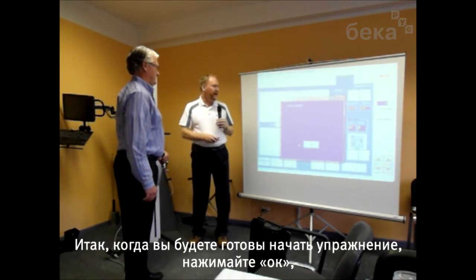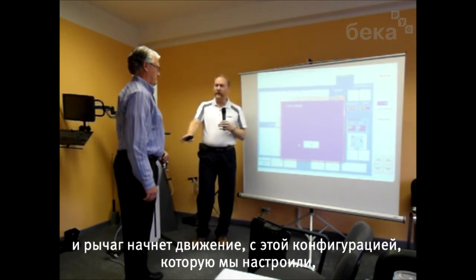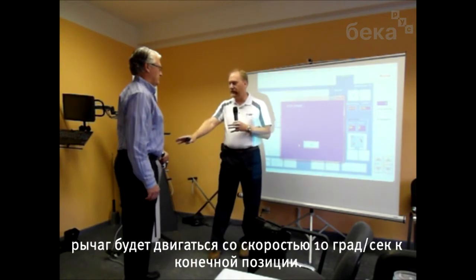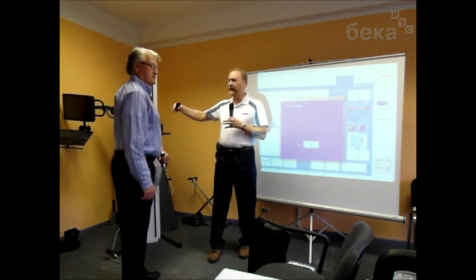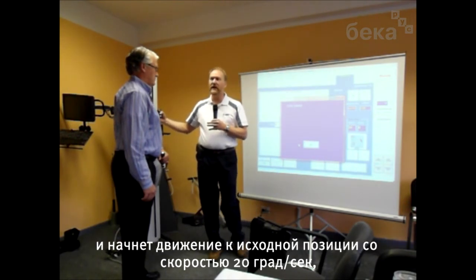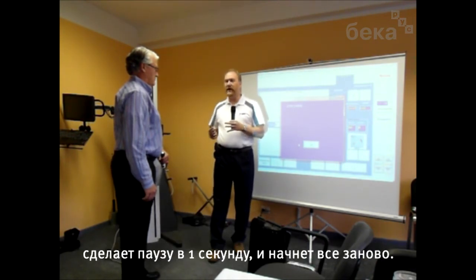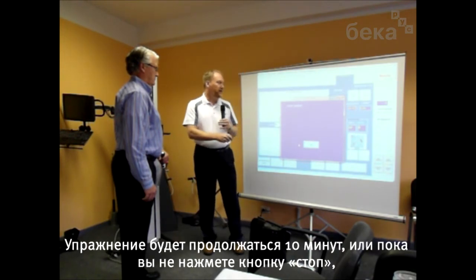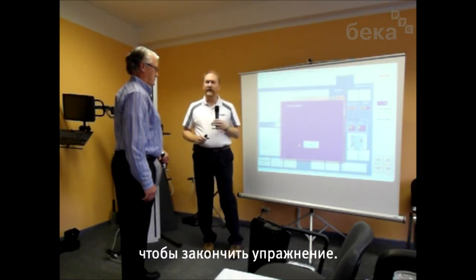Right, so when you're ready to start the exercise, you'll press OK. And then the tool will start moving. In this example that we created, the tool is going to move at 10 degrees per second into external rotation. When it gets to that end point of the range, it will stop and hold the position for 5 seconds, and then return at 20 degrees per second back to that start position. It'll pause just for 1 second, and then repeat the next repetition. And this will continue for 10 minutes, or unless you press the stop button to end the exercise.